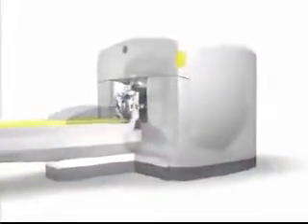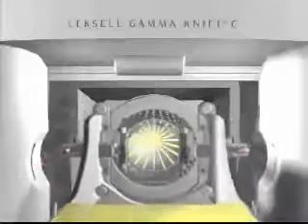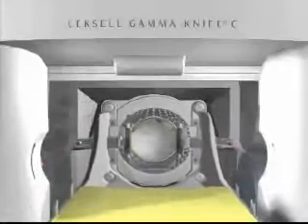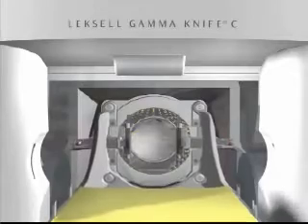GammaKnife surgery is a unique method. 201 extremely precise gamma beams are focused on the treatment area in the brain. The patient's head is placed in a collimator, which is a helmet-like device with 201 small openings for the beams. During treatment, all the radiation beams meet in a focal point with submillimeter precision. The individual beams are too weak to damage healthy tissue on the way to the target area, but very powerful when they simultaneously merge at a single focal point. This can be compared with the principle of a magnifying glass in the sun.